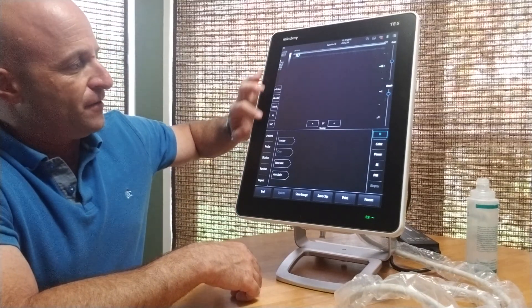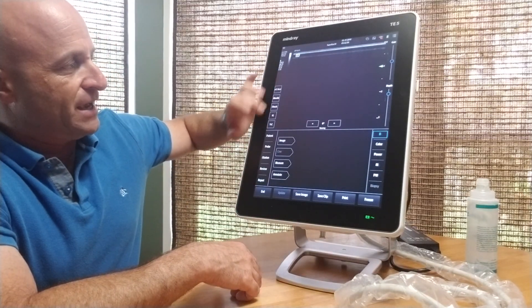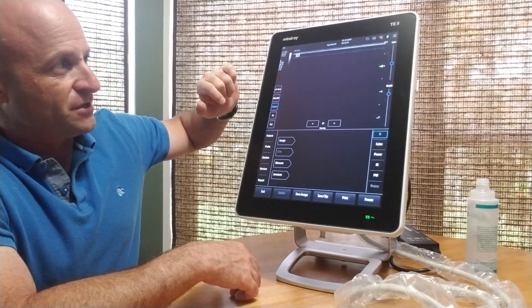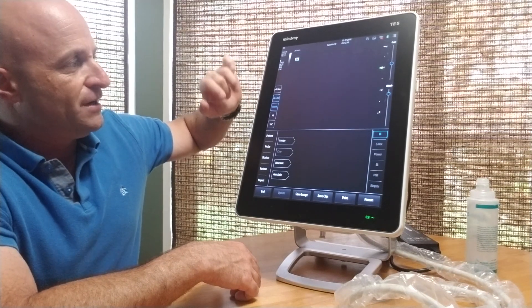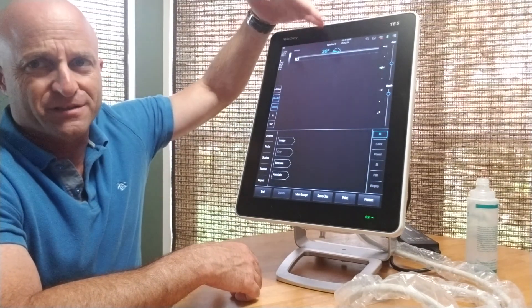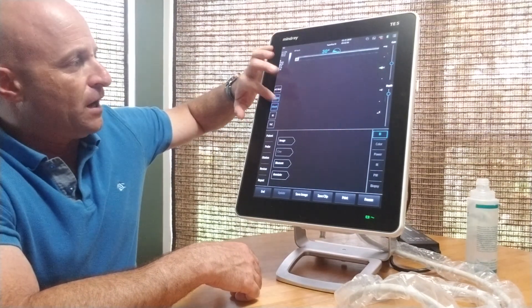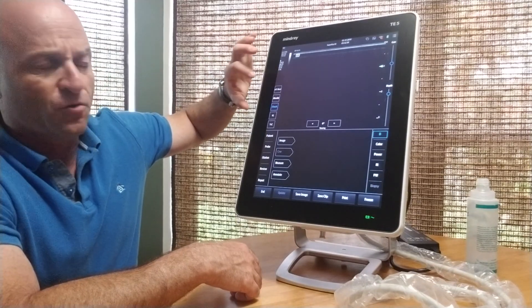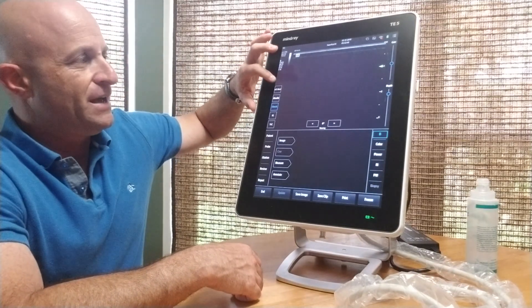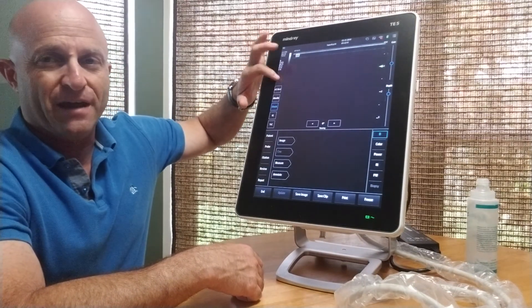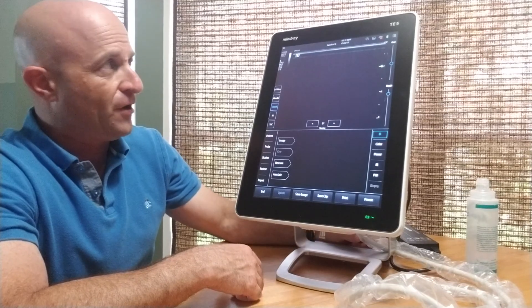You have a number of easy-to-use features. iTouch is an auto-optimization feature, iNeedle is for needle visualization, and systems equipped with eSpatial Navi have the magnetic needle finder.